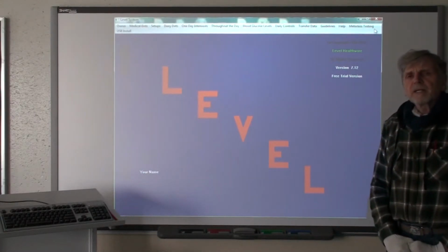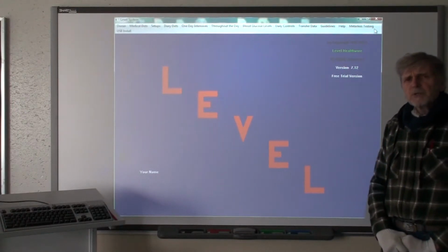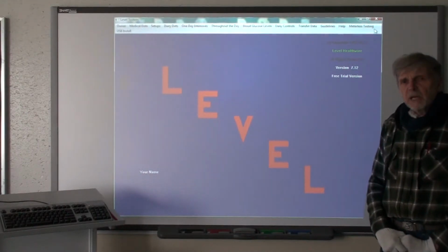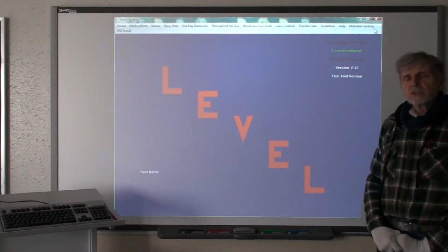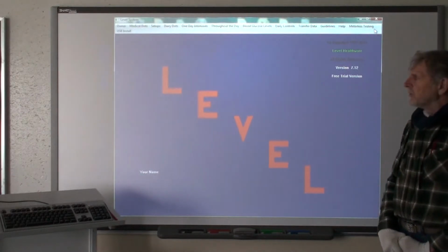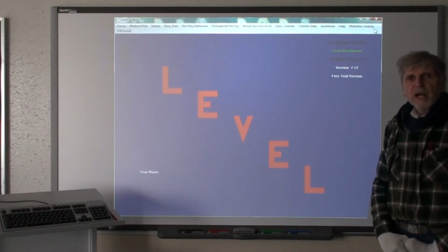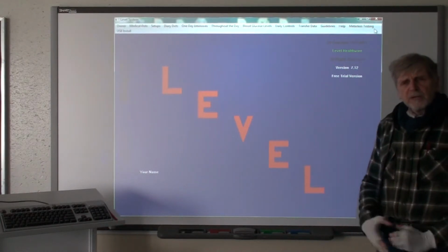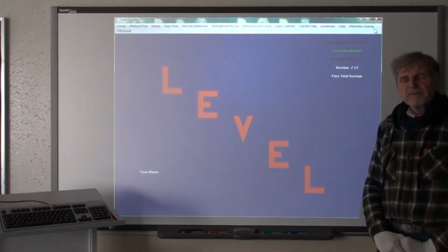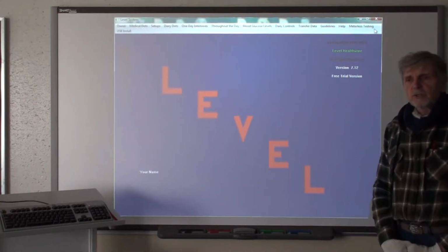This website that you might procure from Yahoo Small Business offers FTP service for file in and out behind the scenes, behind the pages of the website. So Level does not use the pages of the website whatsoever. It only uses the FTP ability of the website to store files and return files out of it. It's done this way by us at Level Healthware so that you have control of that FTP location, not that it is some server of our own and out of your control.